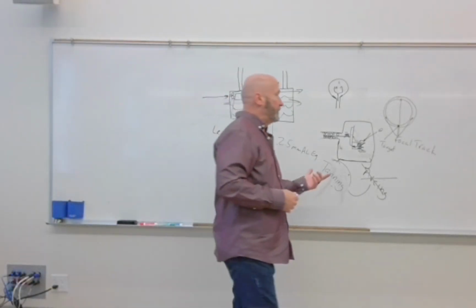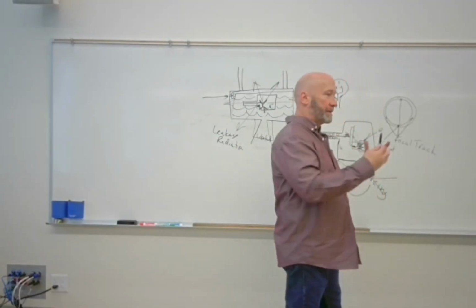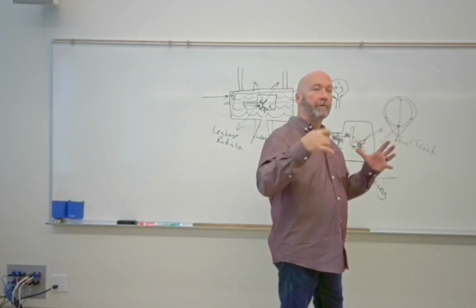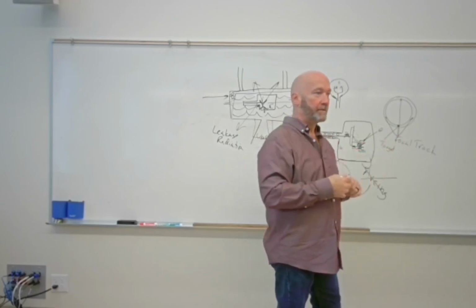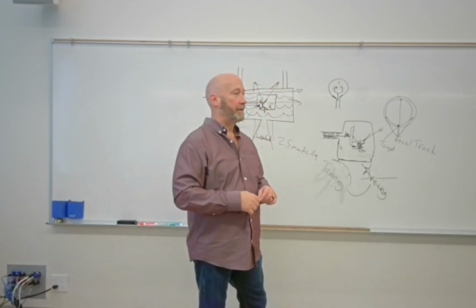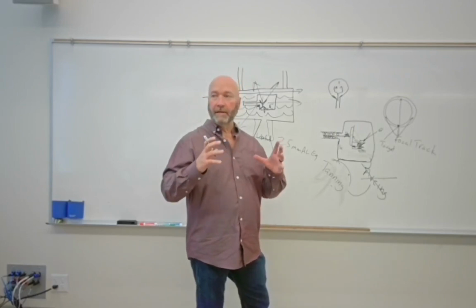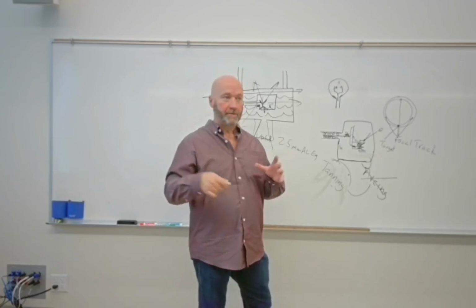So the rotation of the anode helps us to dissipate some of that heat. We can also use a larger anode, a larger disk, to further dissipate the heat. We can also rotate it faster and faster, right? So some of your CT X-ray tubes and special procedures X-ray tubes use a very large disk and it rotates at something like 10,000 RPMs.